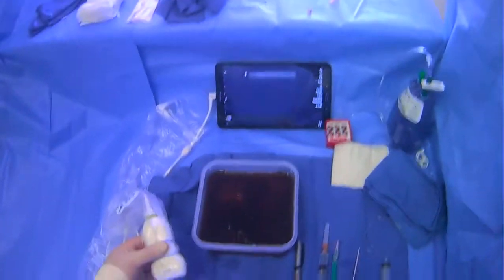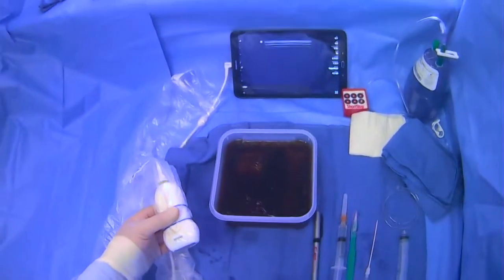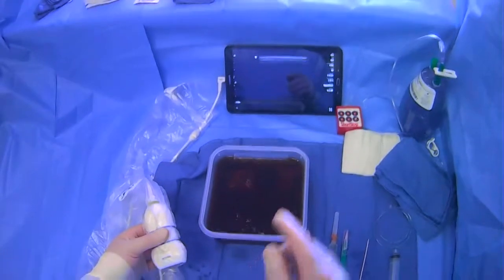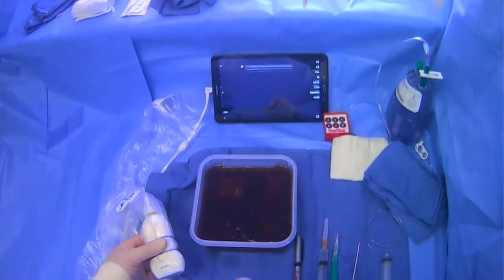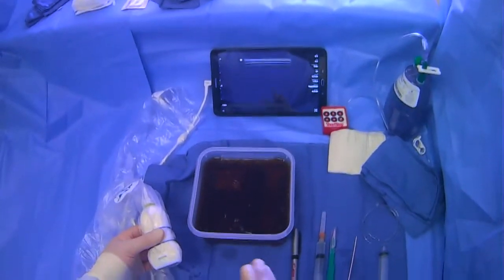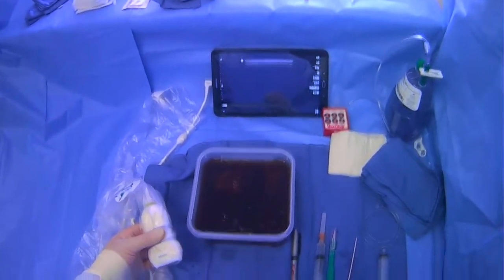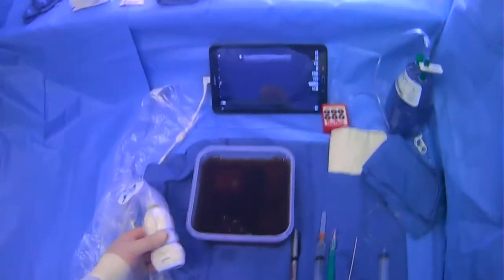During the case, if you're going to use ultrasound to localize your needle in real time, it can be easier to track your needle with a linear probe. Regardless of which probe you're using, you want to take a few key measurements: measure the distance to the tip of the collection of ascites, have a general sense of how deep you have to go to be right in the middle, and also define the deeper edge of the ascites — basically, how deep is too deep, and how deep will you go to get into dangerous structures behind the ascites.